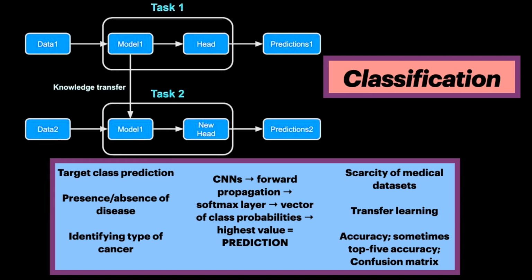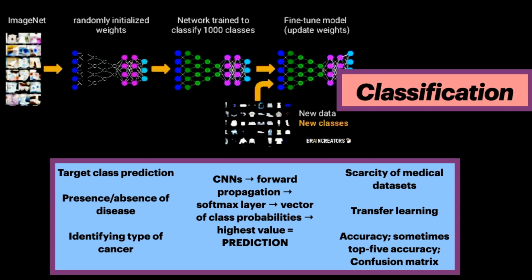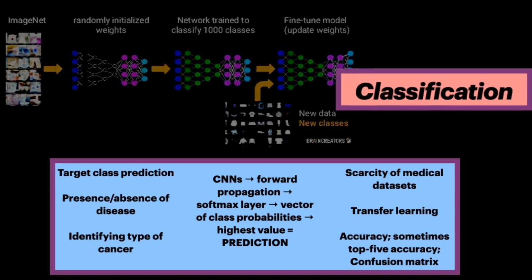practice. To manage the scarcity of labeled images, a common strategy is to pre-train a CNN first on a task for which there is a sufficient amount of data available. This technique is called transfer learning. Since models pre-trained on the popular ImageNet challenge dataset are now widely available, many authors have achieved good performances by reusing pre-trained generic architecture and fine-tuning the final layers of the network to fit a relatively small and specialized dataset.